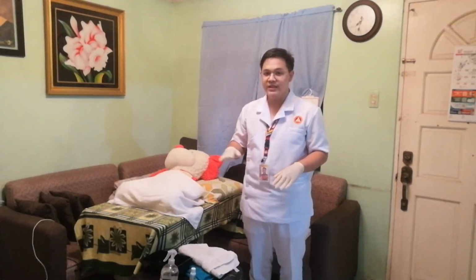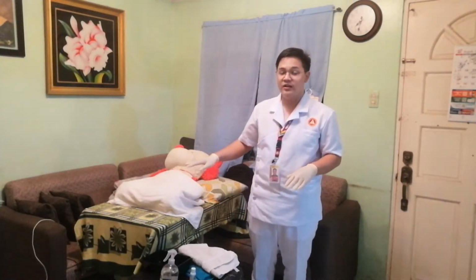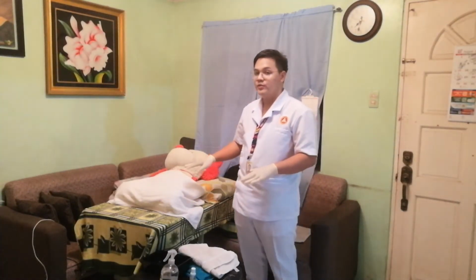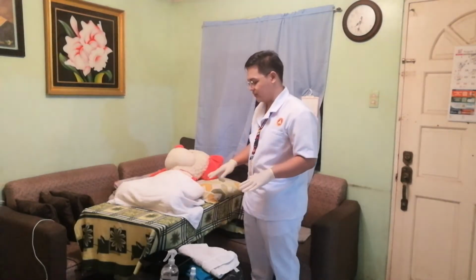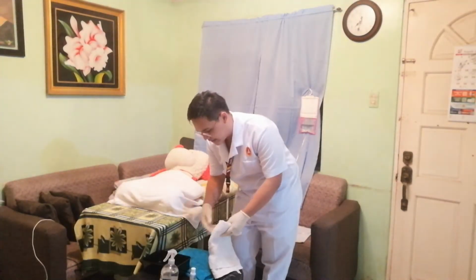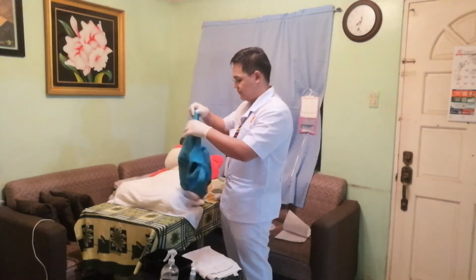So for our next step, we will need to place or position our client to a left lateral position with his or her feet or legs flexed, acutely flexed as much as possible. And after that, we will be putting the linen saver, a pad under the patient's buttocks. So to do that, first we will need to cover the patient with a bath blanket and we will be removing the top sheet, okay?